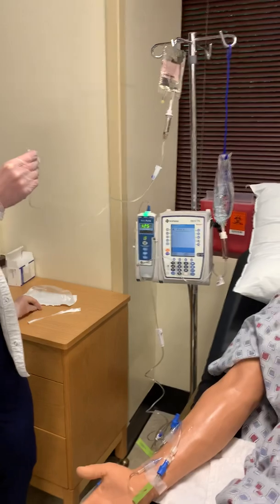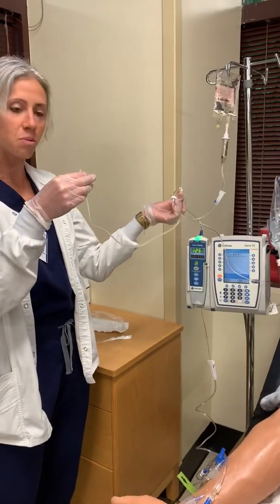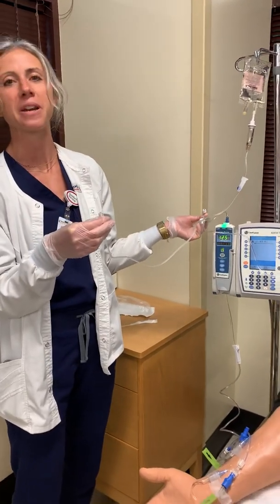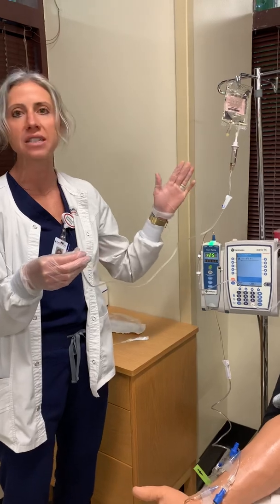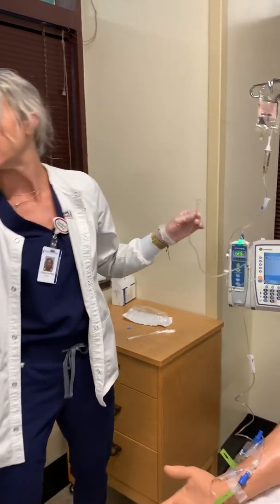Now, where does this go? Okay, so let's talk about that. Because this is very different than this tubing. You've got this beautiful port right here, okay? Has this been open to air? Yes, it's been open to air, okay? Now, when you're doing all of these things at once, if I was setting up a primary and a secondary all at once, it's a little bit different, but in this case, I haven't.